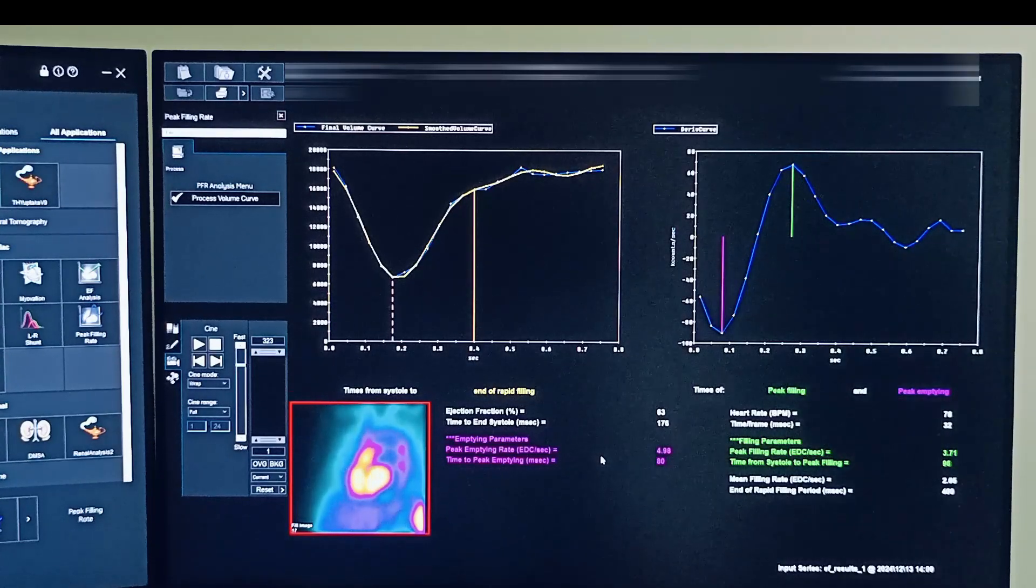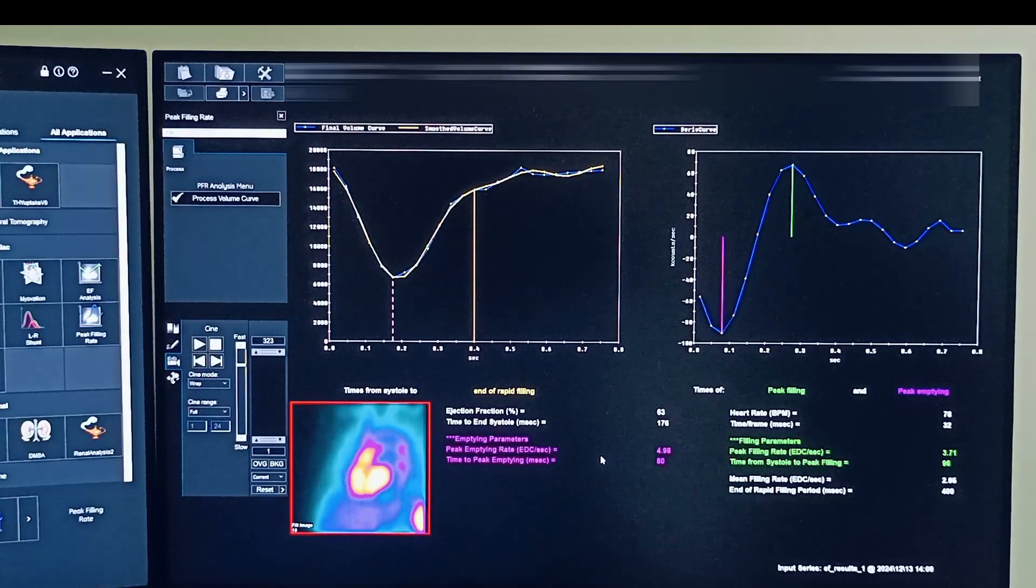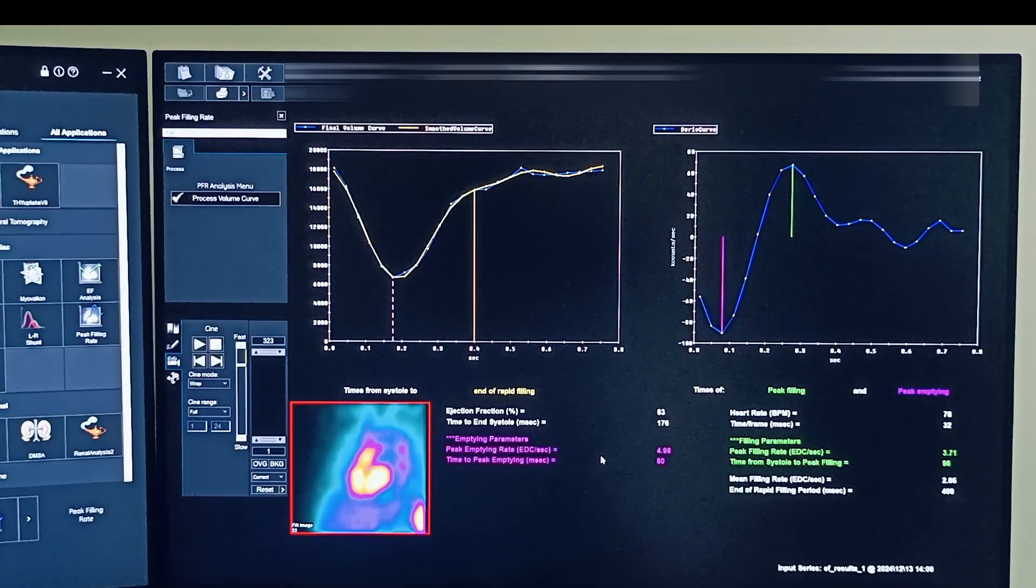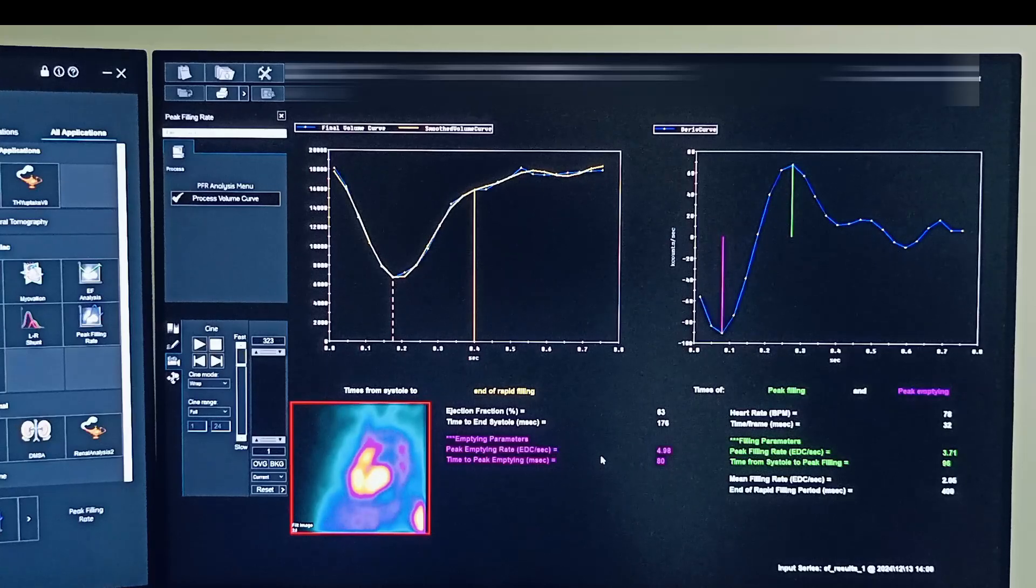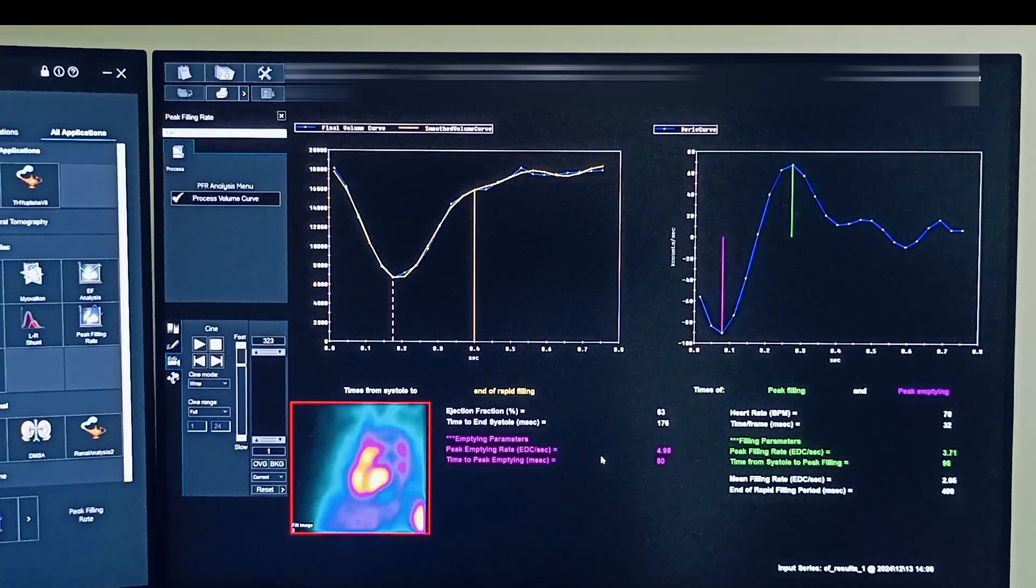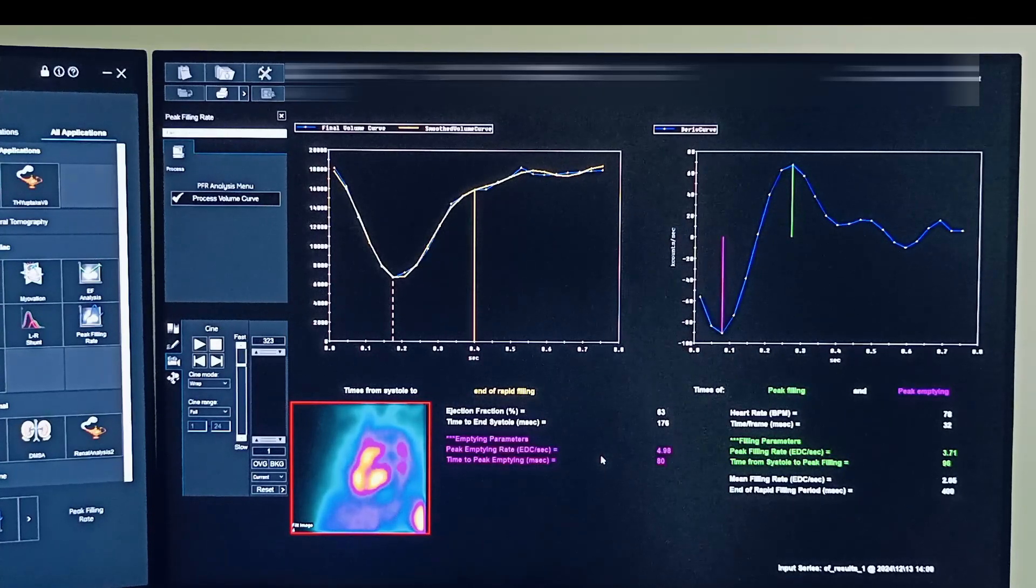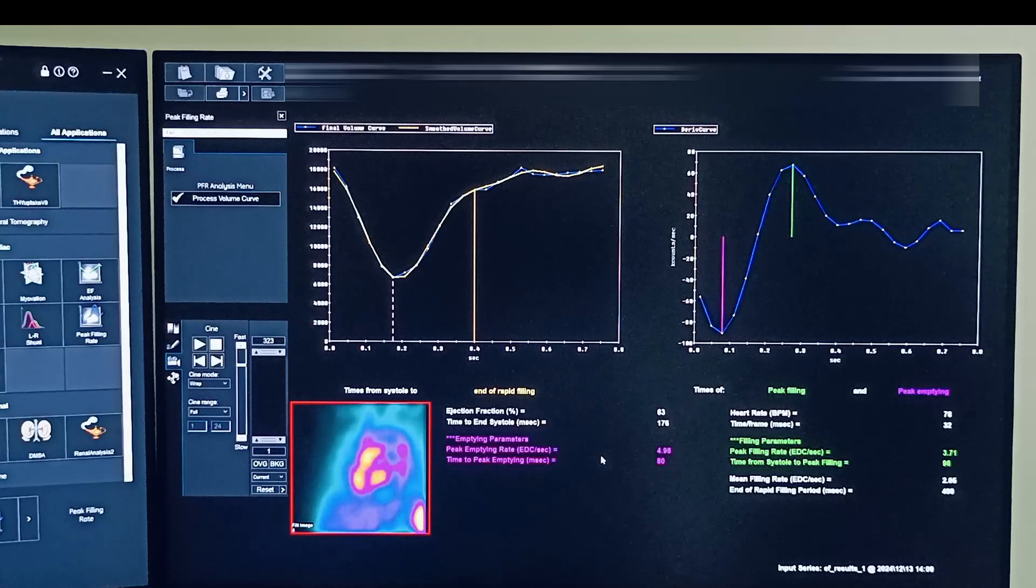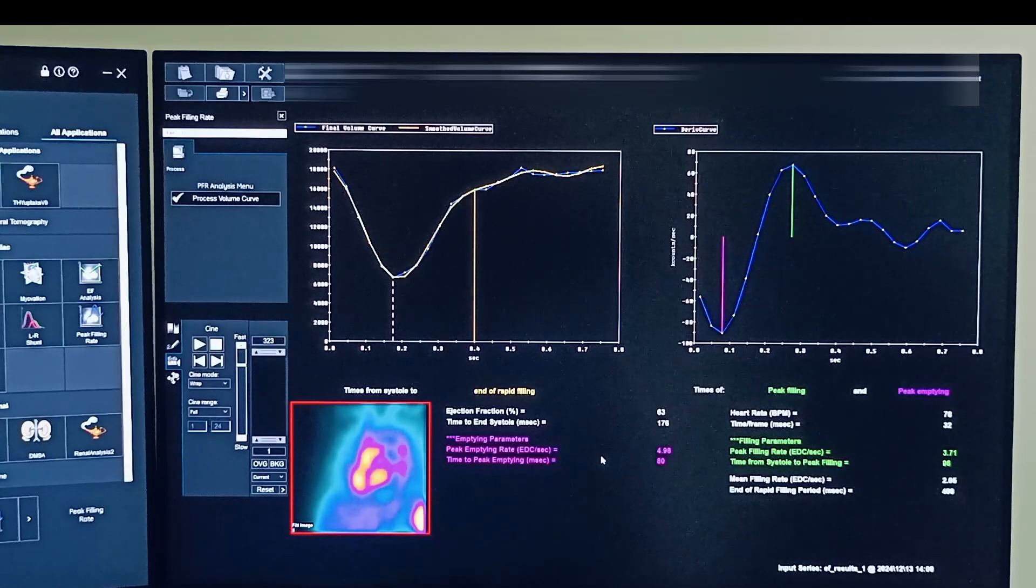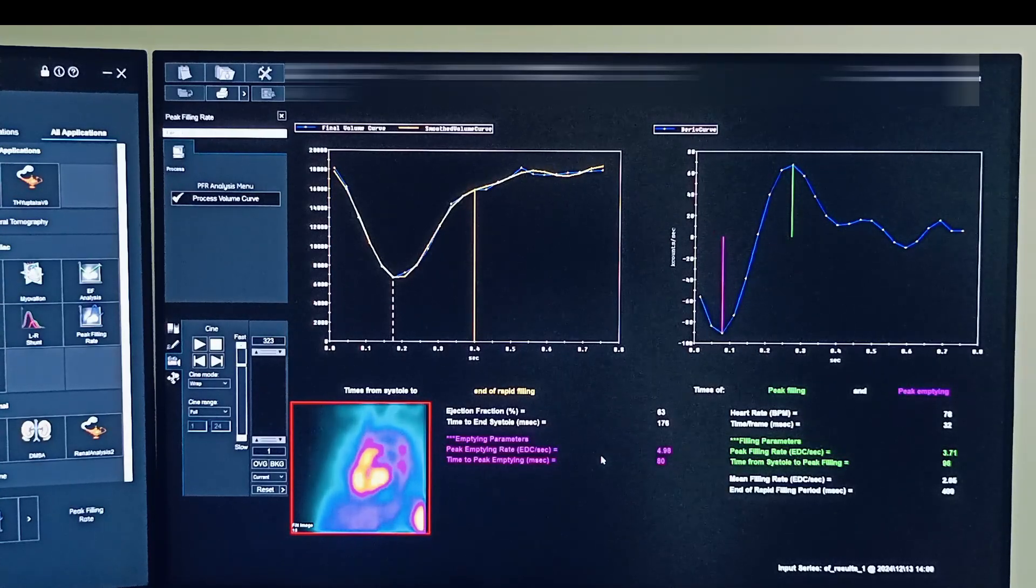But if the patient is under some synchronization therapy, resynchronization therapy, then in that case you can also provide this. This page also includes the ejection fraction plus more information on the LV movement.